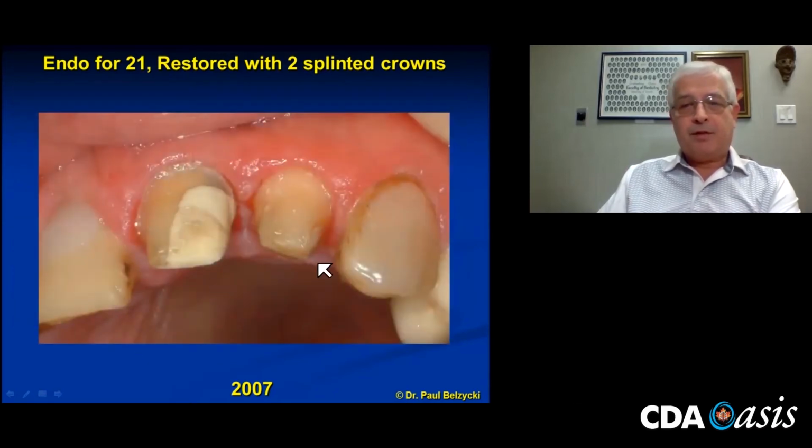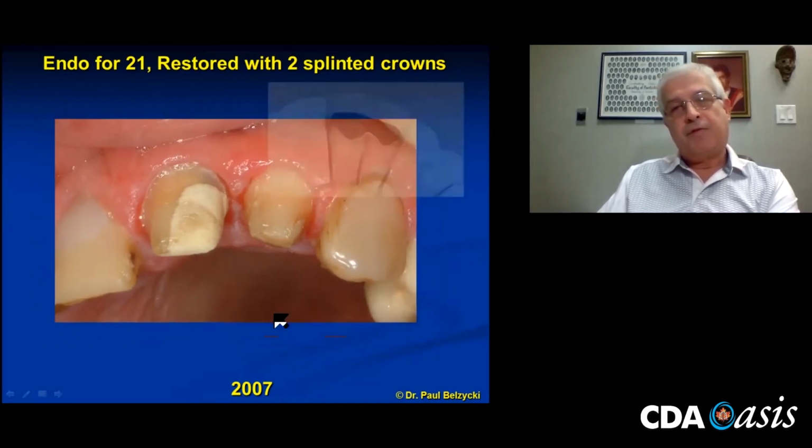Prepared both teeth. When I prepare a margin, I try to follow the soft tissue outline. Come coronal when I have to, apical when I have to, and just not go around 360. You have to follow the undulations of the gingival contour.